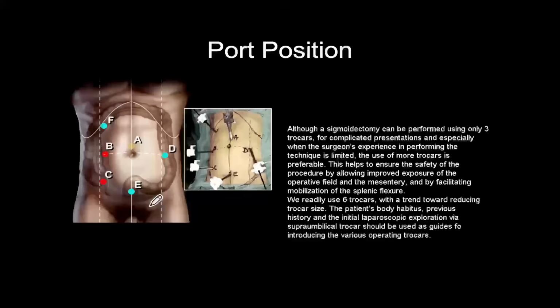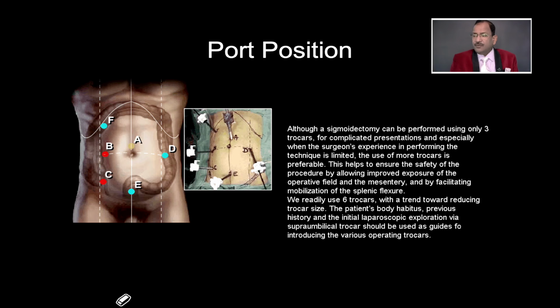And those are laparoscopic assisted. Total laparoscopic is not possible. So the mobilization part is the most important part, where laparoscopy has an advantage, because mobilization is very easy by laparoscopy compared to open. And you can have triangulation everywhere. Ports should be introduced in such a way.